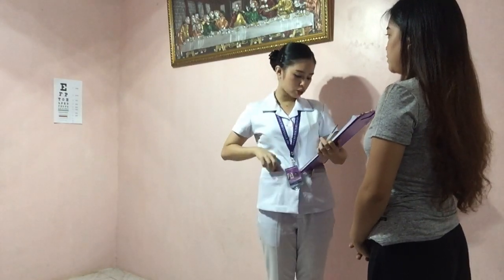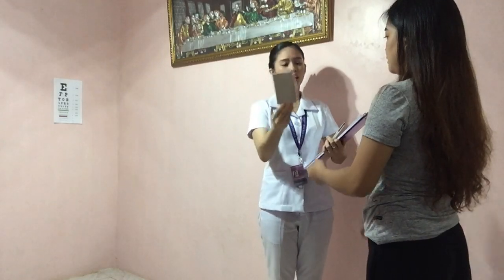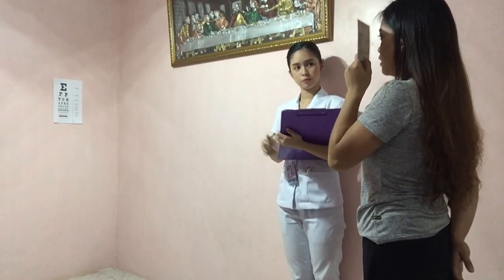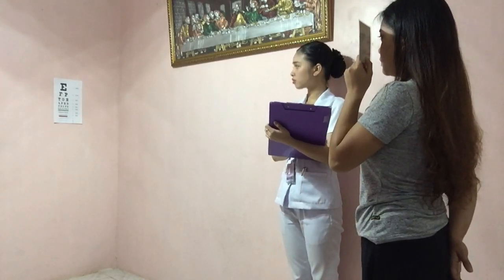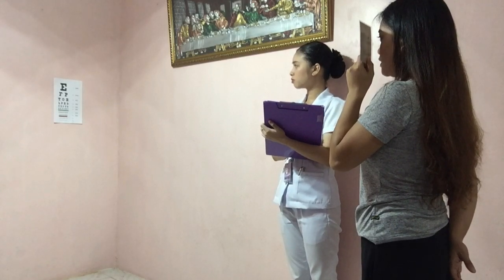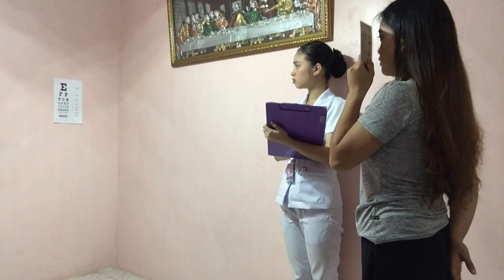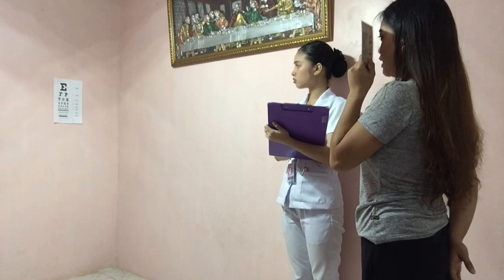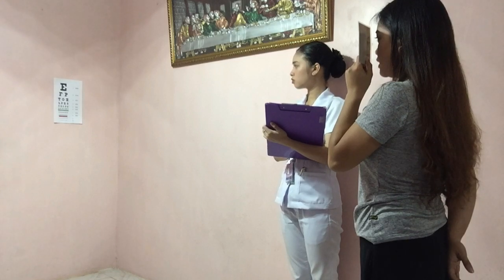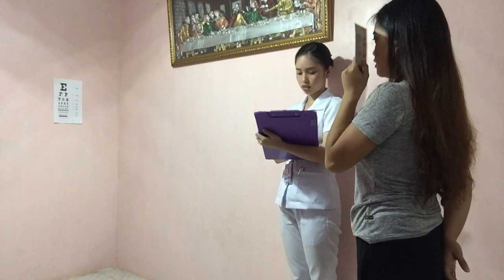So Althea, can you cover your left eye for me? Then read the letters. E, F, P, T, O, Z, L, P, E, D, P, E, C, F, D, E, D, F, C, Z, P, F, E, L, O, P, Z, D, B, E, F, P, O, T, E, C. Okay, that's good. Can you cover your right eye for me?